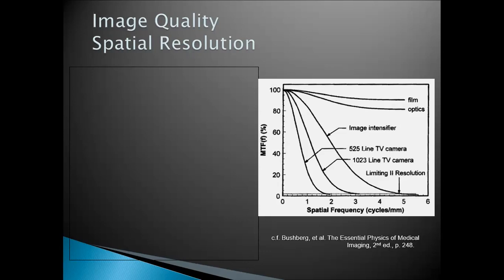This is film. Spatial frequency is in cycles per millimeter. These are the MTF curves, as the case may be.